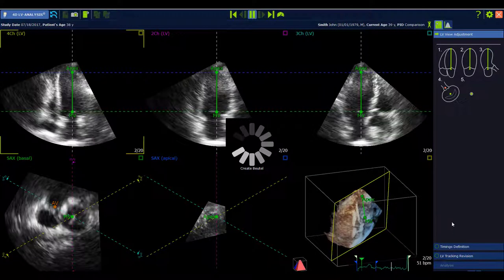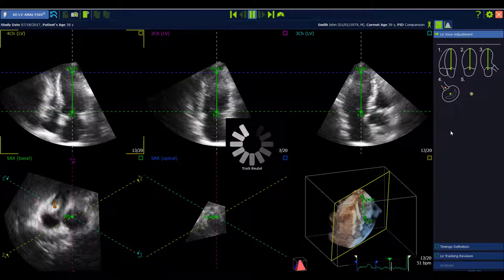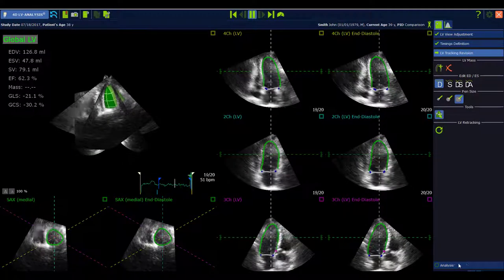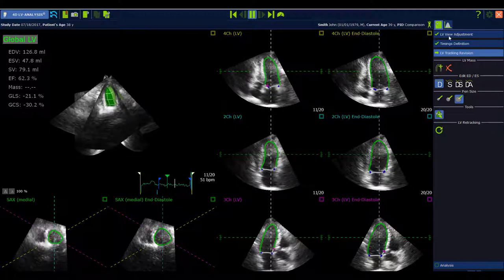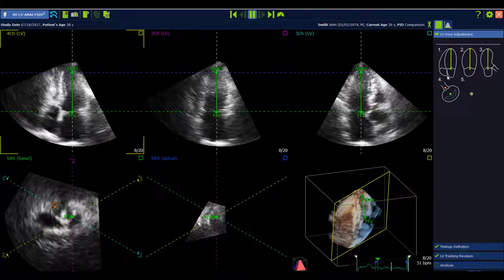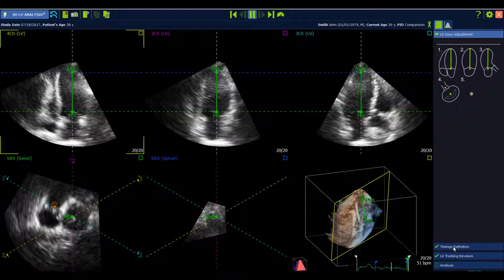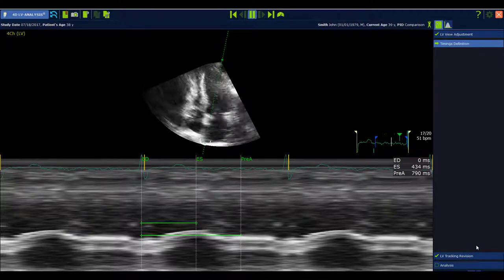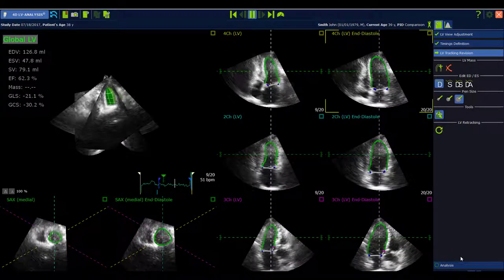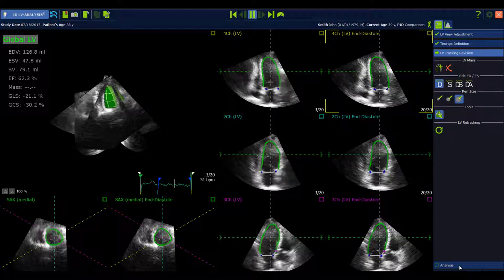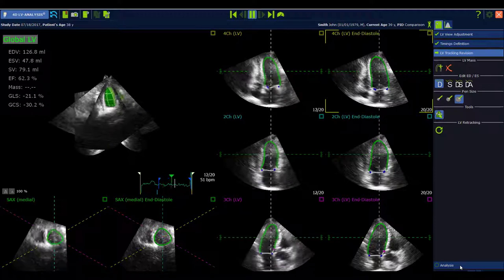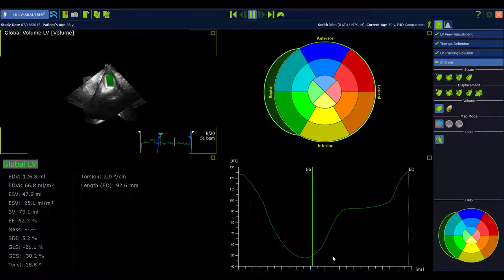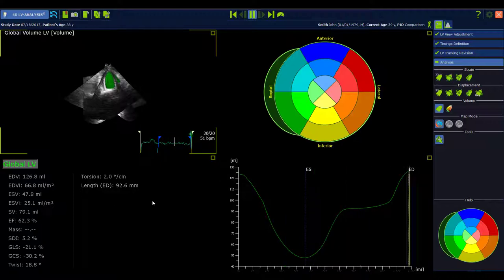For the LV analysis, the workflow has changed — there is now a direct start in the analysis state, so the software automatically jumps to the analysis on launch. It is always possible to go back to the view adjustment, where the GUI now describes the steps you have to perform. Then there is the timing definition step, followed by LV tracking revision where you can see the tracking of the full heart cycle and perform contour adjustments. The last step is the analysis, which is familiar but now includes an added measurement: the length of the ventricle.